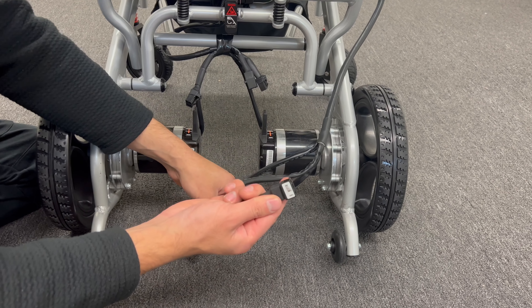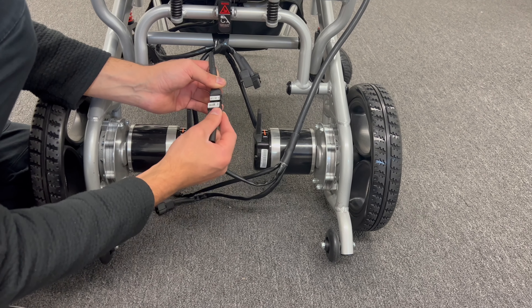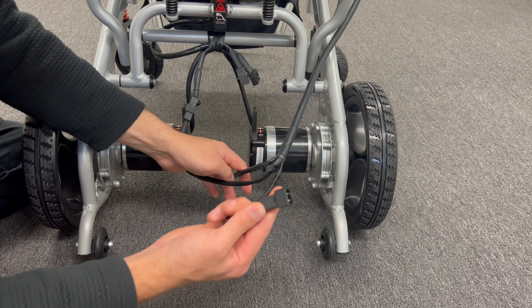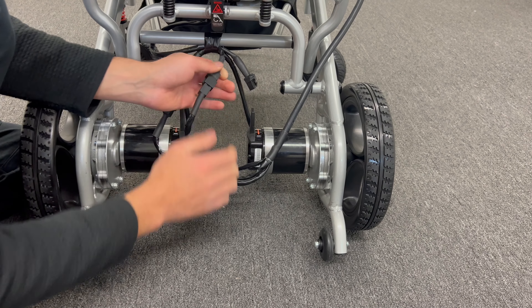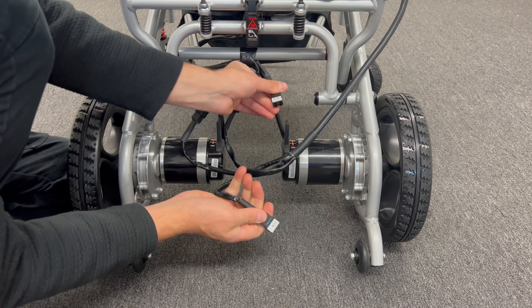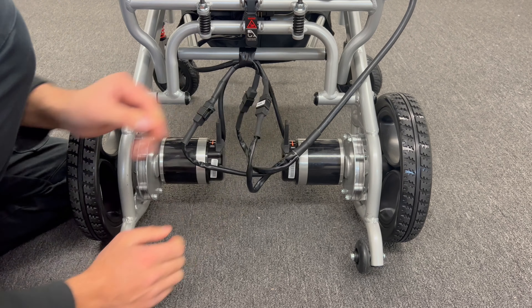Now I will put them on and show you. First, just hold the right — whichever one you want to start with, it's up to you. Here is the right motor — I found it and I put it. And here is the battery; just find the matching battery connector — the same one. Then put it in, and the last one is the left one. You can see the letter L on both. Put it in and it's ready to use now.